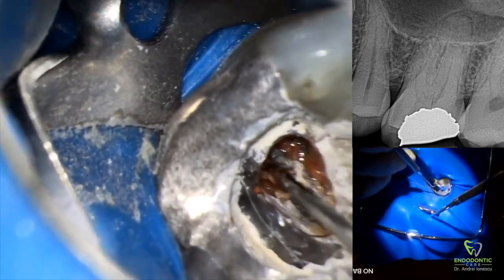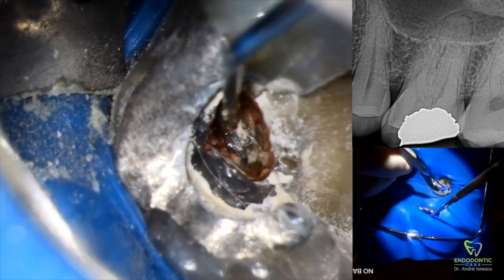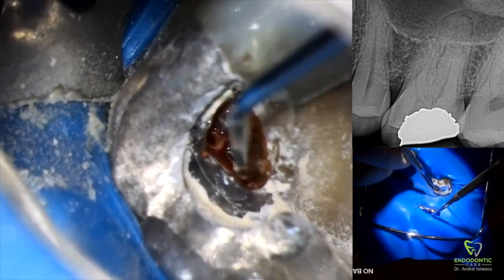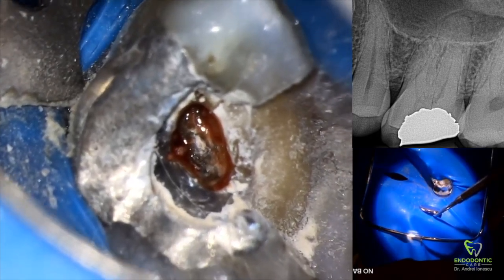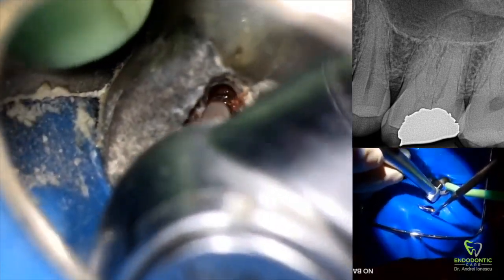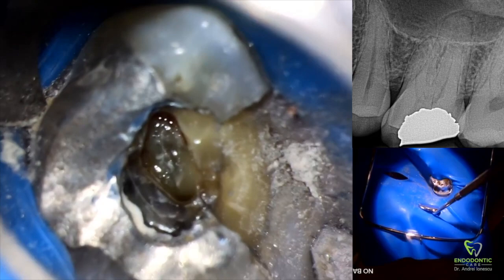Now we have the mesial buccal and the distal buccal canals. You can see the shape that we had in mind. Take a look at the pulpal floor — the dentin now has a glassy green appearance. We know this is tertiary dentin or pulp stone on the pulp floor. We're going to leave it for now and try to see if we can get into the canals.